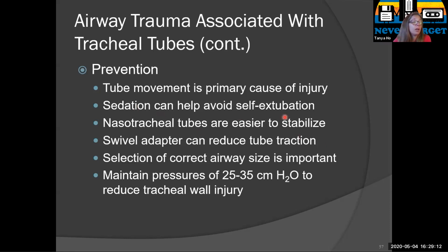Sedation can help avoid self-extubation, because as patients, again, you have an endotracheal tube in your airway. This is very uncomfortable. It is not natural at all. So as soon as people start waking up, they're going to start reaching and trying to pull it out, and they're not with it. So we want to try to perhaps keep them slightly sedated, just to help them tolerate having the tube in.